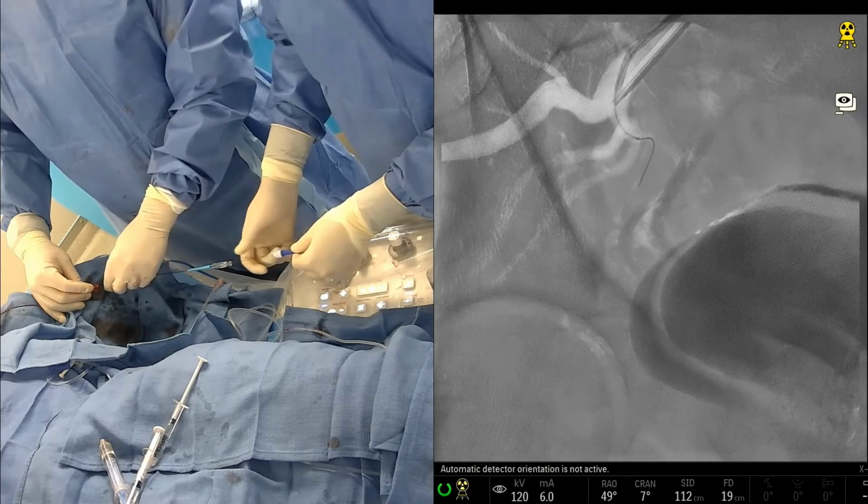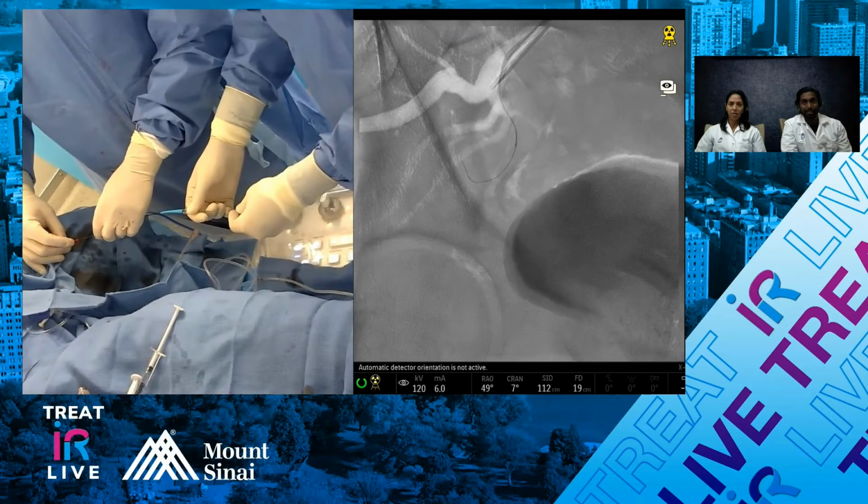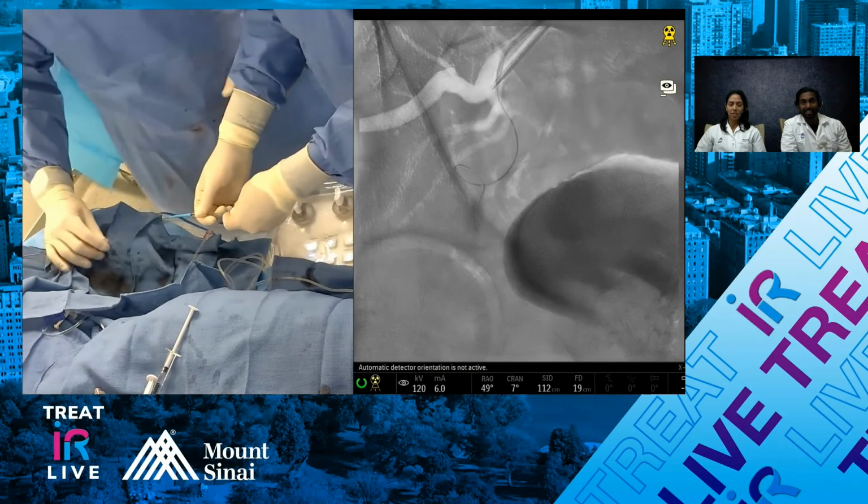Yeah, it's because she said 5 minutes. Alright, 5 minutes. See if you can get a little more wire in. Yeah. Just needed a little. That's great. Yeah, so there's your loop, right?